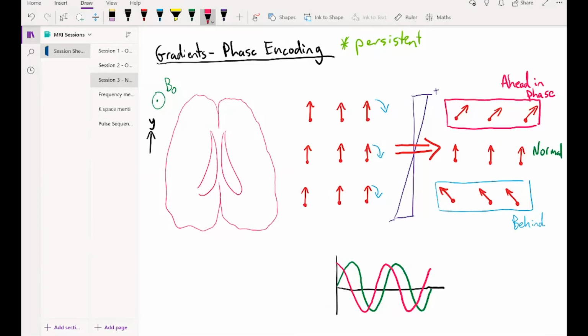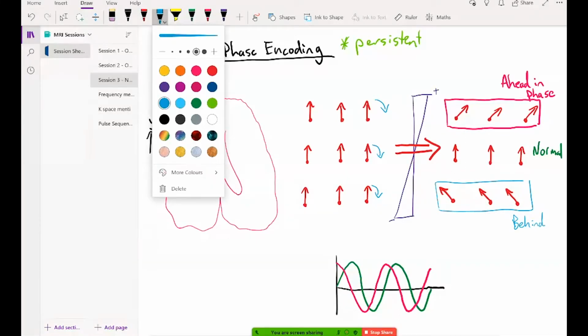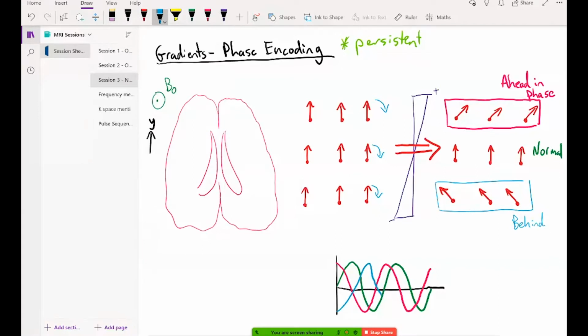And then just to kind of fill this out for everybody, the blue signal in this example, that again is very exaggerated, but hopefully helps to make things visually represented as well. Yes, clear as mud now, right? The blue signal is behind in phase. It's taking longer to get to any given point than the green and pink signals are.